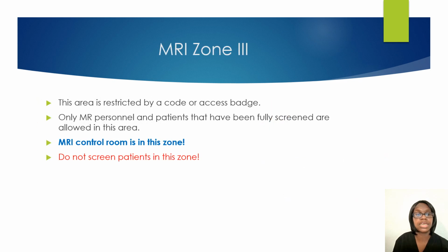MRI Zone 3, this area is restricted by a code or access badge. Only MR personnel and patients who have been fully screened are allowed in this area. The MRI control room is in this zone. Do not screen patients in this zone.